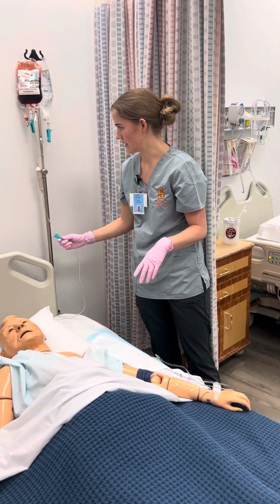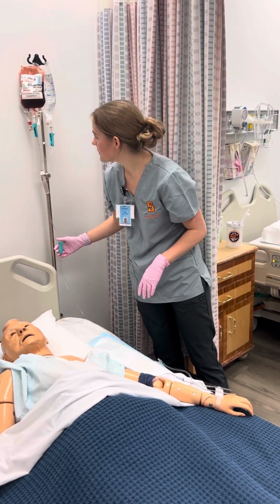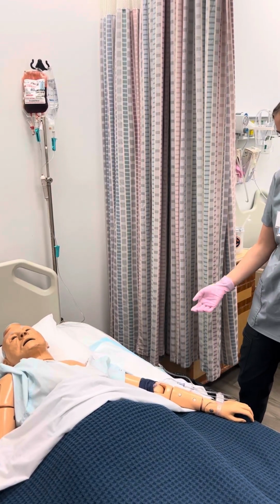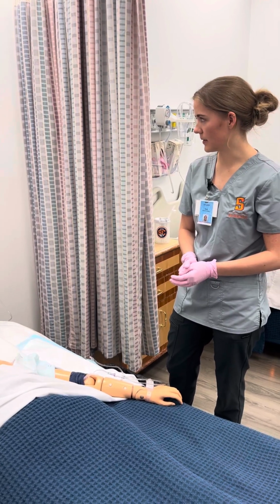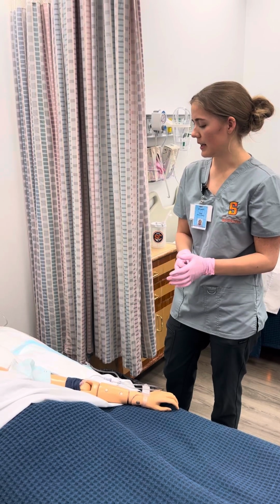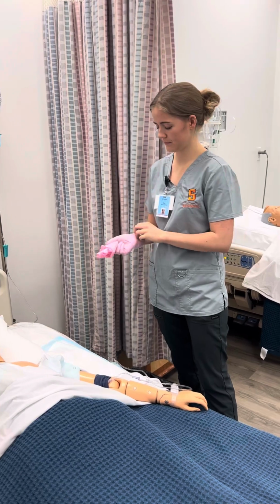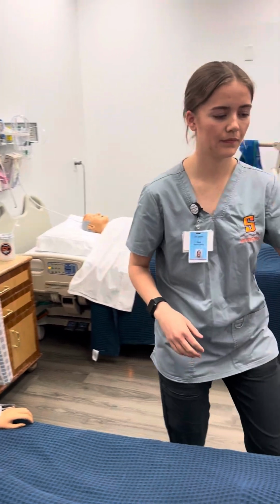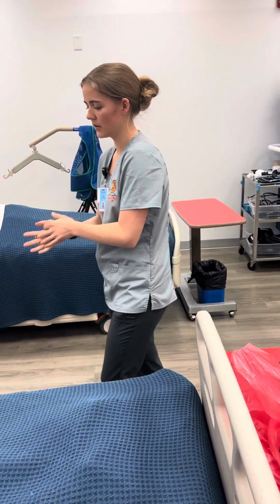And I'm gonna make sure that I stay with my patient this time. Okay, and I'm just observing for any reactions. You feeling okay? Great. And then I'm also going to obtain a set of vital signs after the first 15 minutes. And after that first 15, I can adjust it to the prescribed rate. Make sure to document everything. And then we're just making sure it's okay.